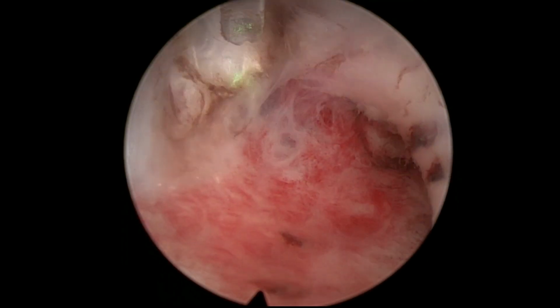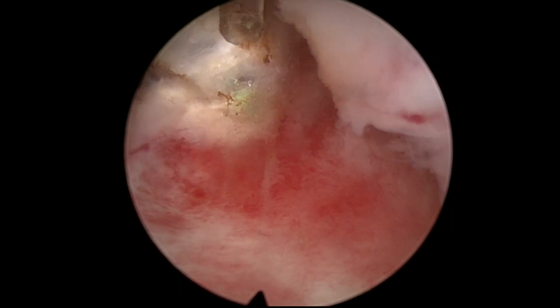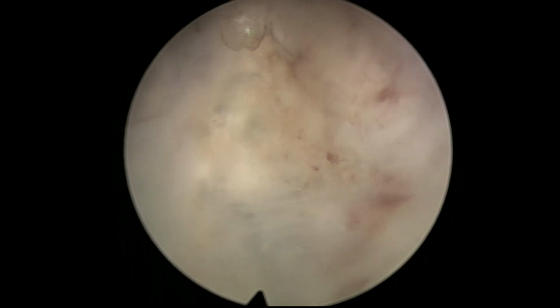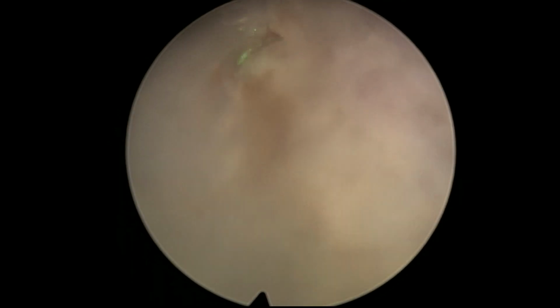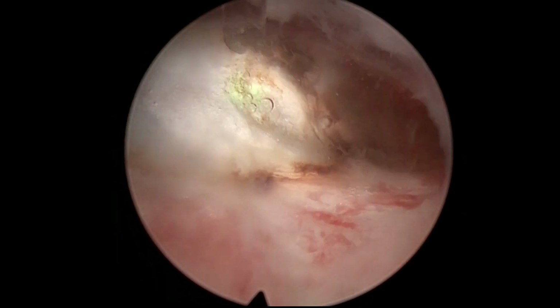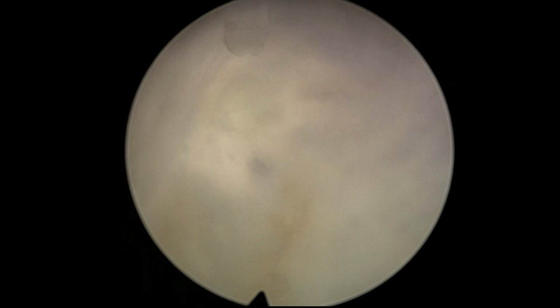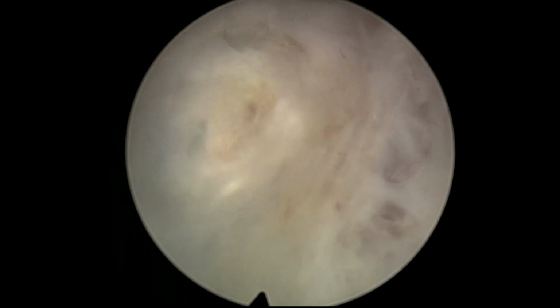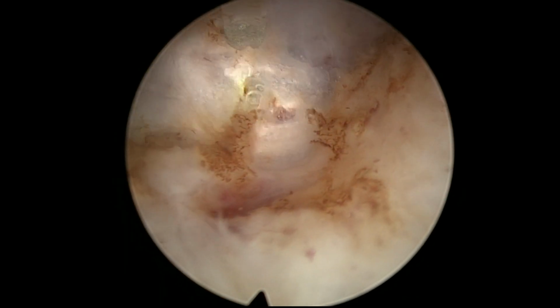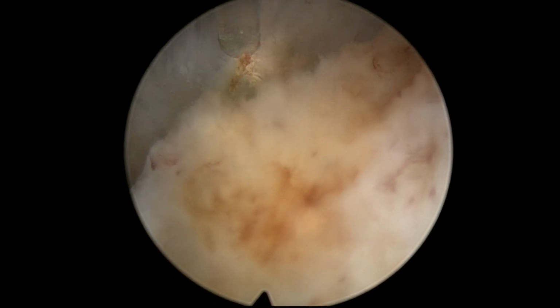One of the advantages of the en bloc technique is that you have this line that goes around the prostate that tells you where the plane is, and we have to agree that the shape of the prostate is not a perfect sphere, it's not like a billiard ball, but it's quite spherical. So if we follow this line and we are discriminating if we are in the right depth of the capsule or not, you can discriminate very nicely when you see the plane very beautiful.